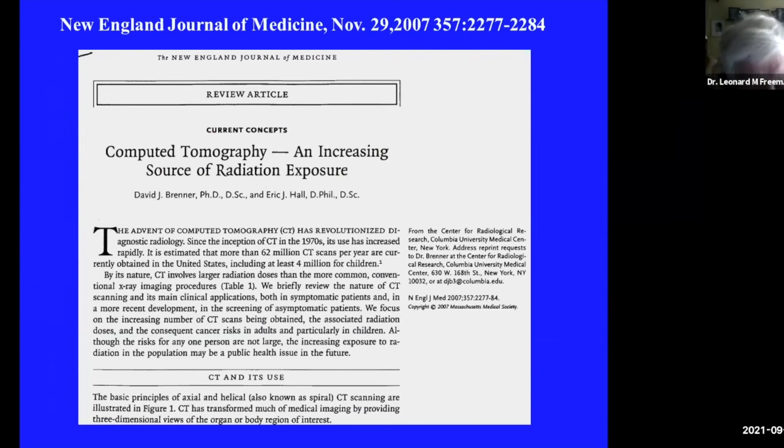CT basically has been criticized for two things. Number one, of course, excessive radiation, particularly to the breast. So that has improved in recent years. But number two is the whole question of overdiagnosis, because CT picks up some of those small little things that I just mentioned, and they will be anticoagulated. So CT critics have said that overdiagnosis is one of the main problems, and of course, concern about radiation to the breast.